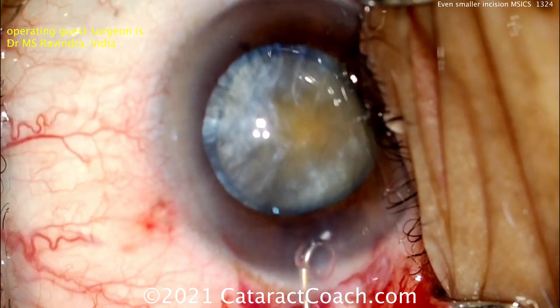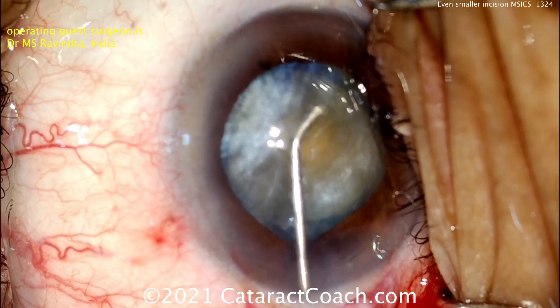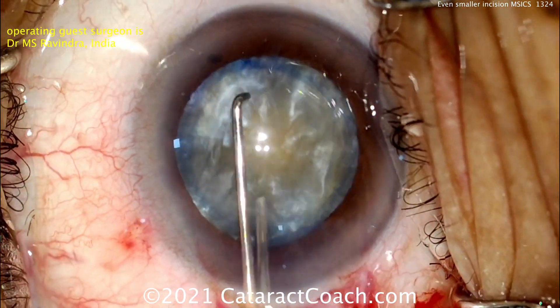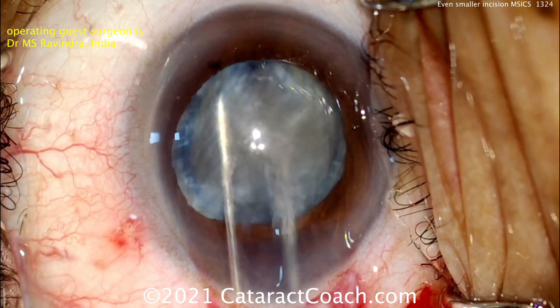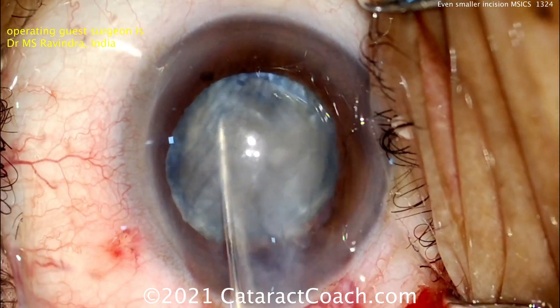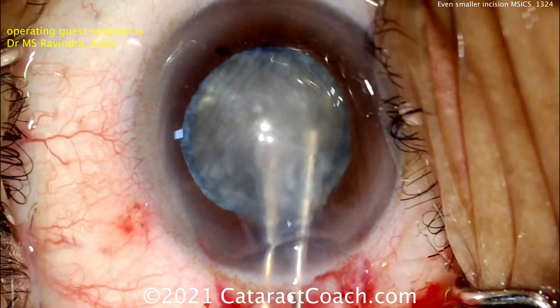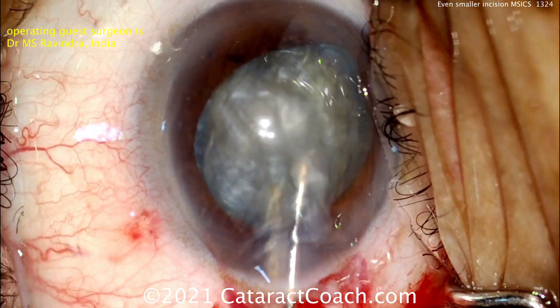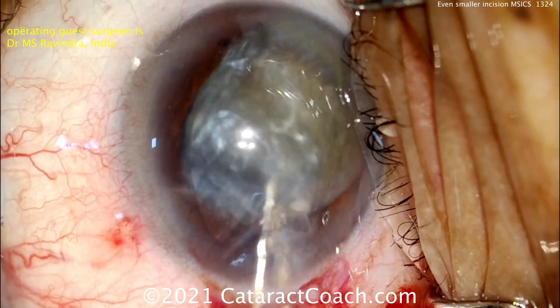So there's our nucleus. Now we've got to get that out of the capsular bag. You can do hydrodissection, viscodissection, or whatever you want. Here he's going to use a sandwich technique. Look at the two instruments to rotate the nucleus, to really express out any of that cortex. You can see it just wants to come right out of the eye. And now he can just use it like chopsticks — pick up that nucleus and bring it up in the AC.